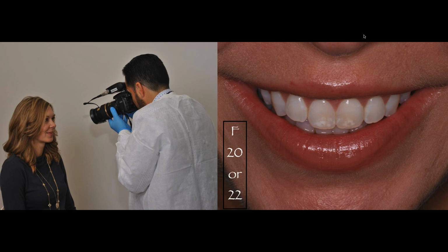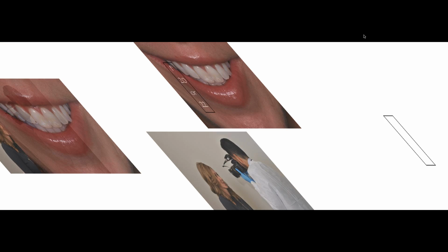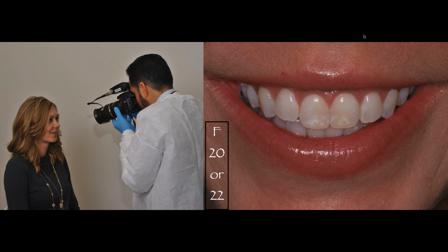This is my first extraoral shot, and I'm a lot closer to the patient compared to the first photo. At the same time, I'm using a higher f-stop because I need less light and I need the sharpness. Don't forget that the other 3 elements we do not modify at all. The only one that I'm modifying is my f-stop, and as you can see, I modify it very, very little.